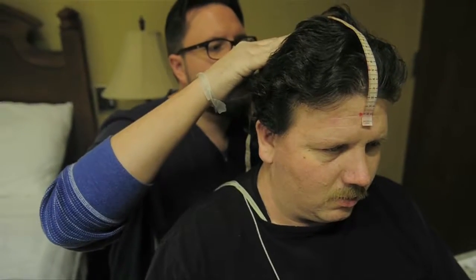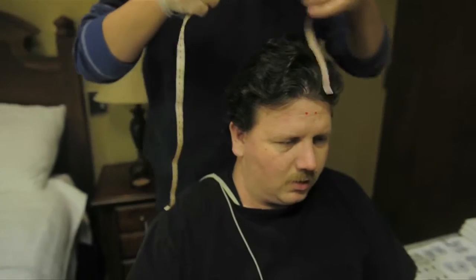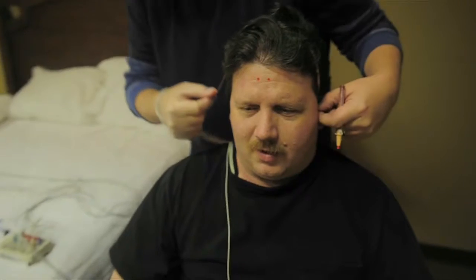We make some measurements for a thing called a partial EEG, where we're just monitoring brain waves that are specific to sleep and wake, so we can tell whether a person's awake or asleep, and then when they are asleep, what stage of sleep they're in.